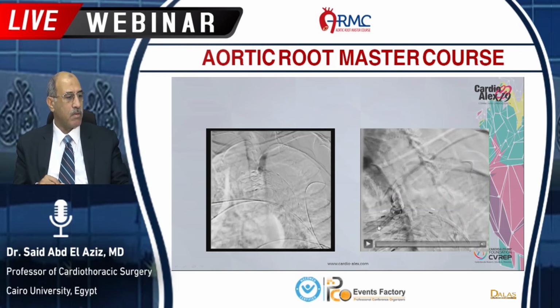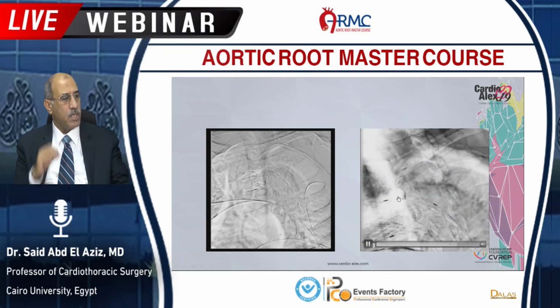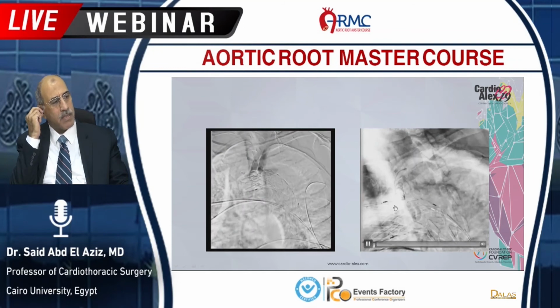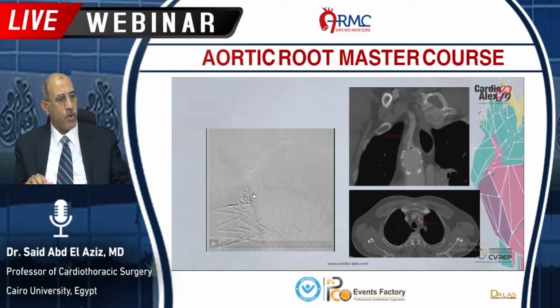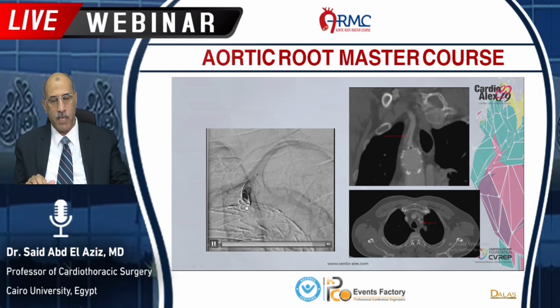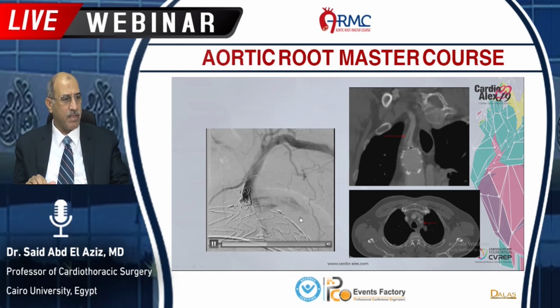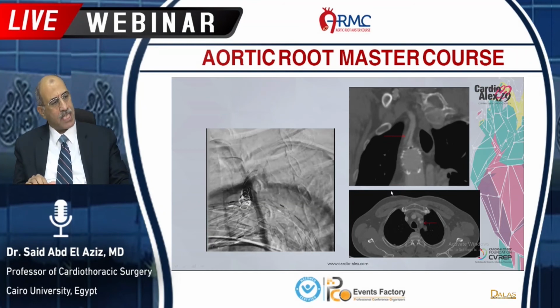So we put for him a coil to occlude the subclavian artery, but I will show you something. After this, we did an injection and still there is a leak. You see here, the coil is here, but still there is a leak going down to the stent in the descending thoracic aorta. This is why those 2 pictures explain why.